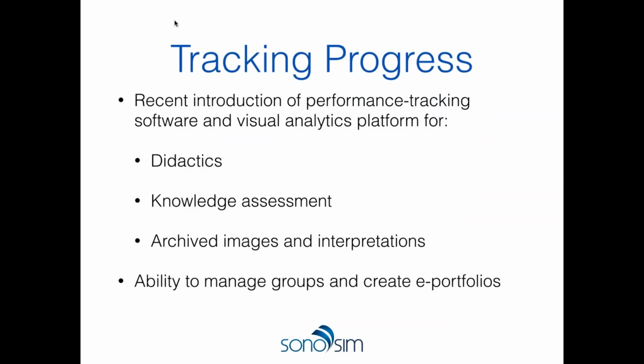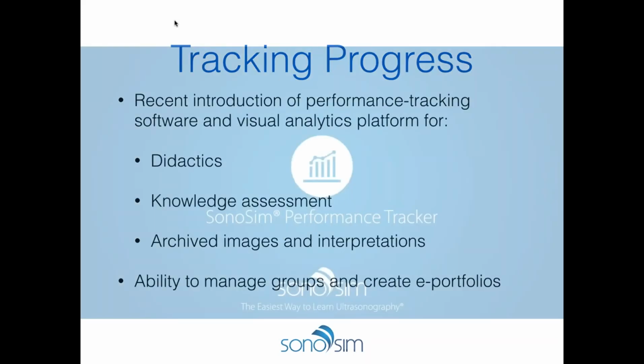So the next component includes the tracking of the progress and the user performance. And to do that, we really needed to create a robust archiving system for the didactics, for those knowledge assessment questions that are presented at the end of each one of these didactic sessions, for the archived images with their interpretations. And we needed to do so in a way that would allow multiple course directors to access that data, and in a way that in the end would yield an e-portfolio for each one of those end users.